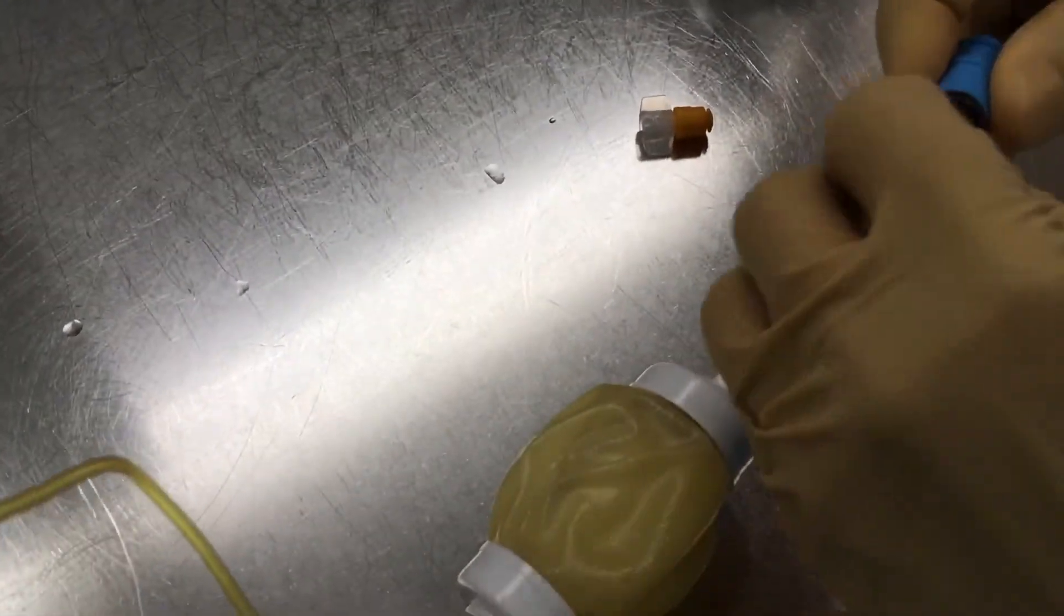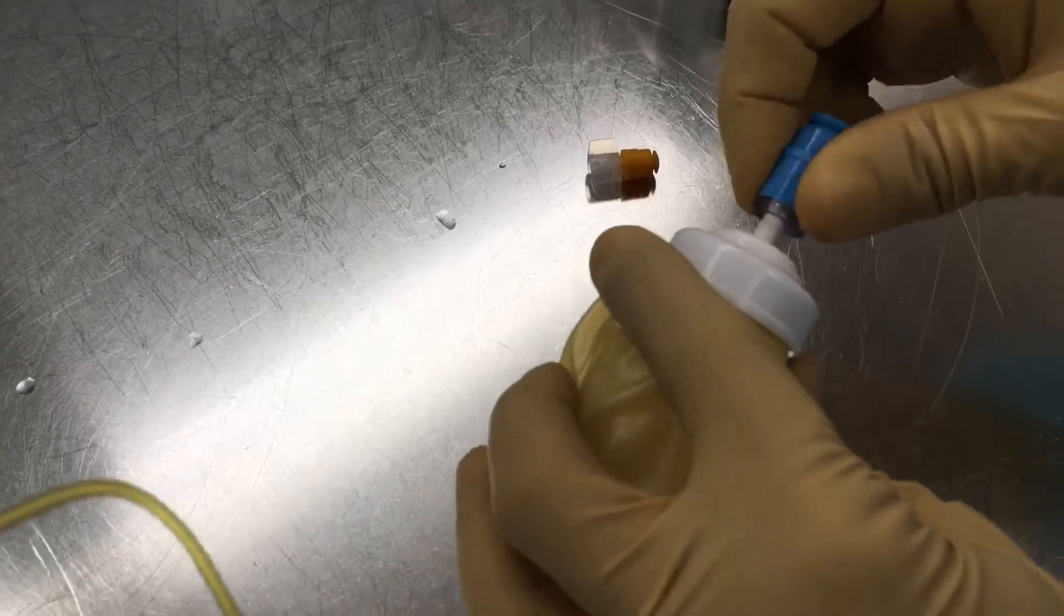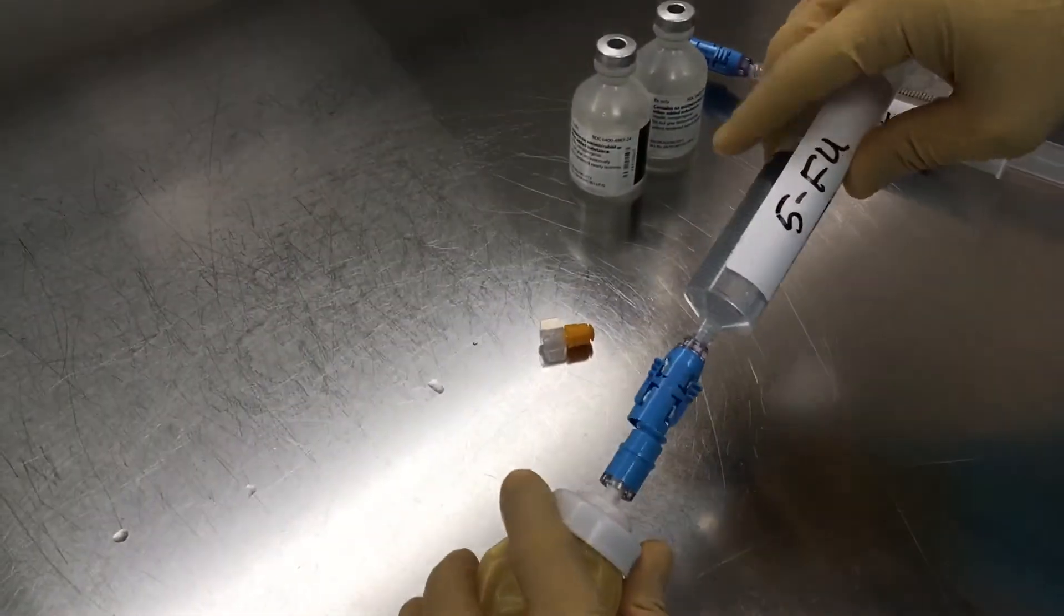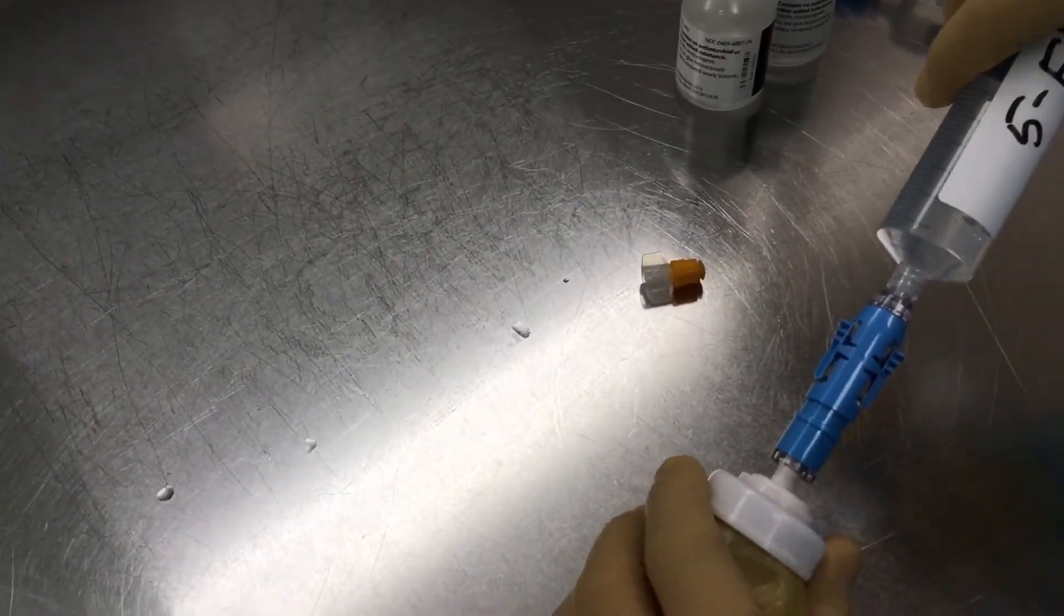You're going to screw it onto the pump. That's where the syringe is going to get locked. Don't overtighten this piece because you're going to have to unscrew it.